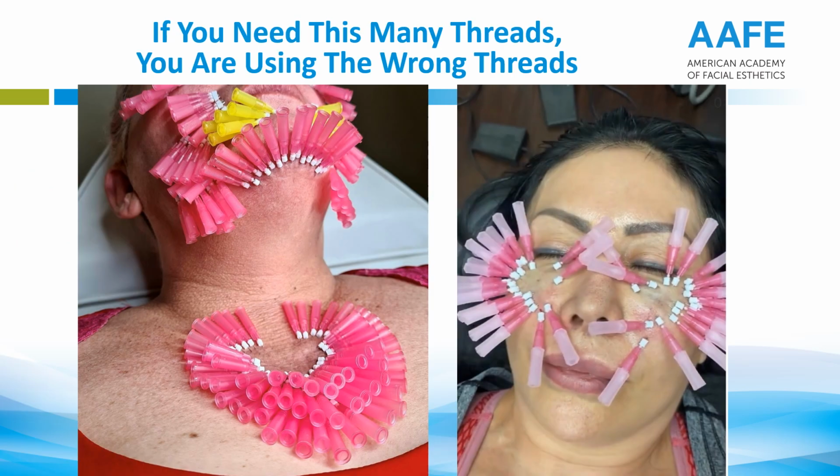And take a look. If you literally are using this many threads, I've got to tell you, this just gets crazier and crazier. And people proudly post this on social media. If you're using this many PDO threads, you're using the wrong threads. I would tell you, with this many sticks of a needle, you don't even need the PDO thread to get collagen production. The body will just give you enough collagen just healing itself through this. I hope most of you, in my opinion at least, agree this is absolutely insane.